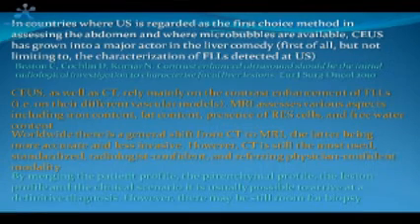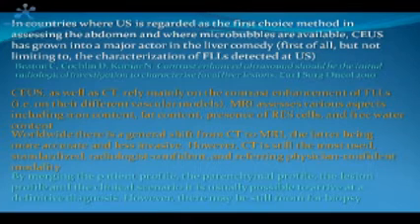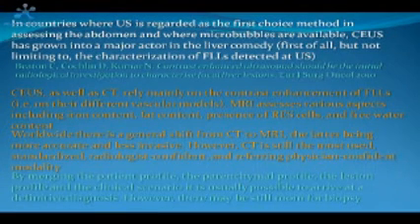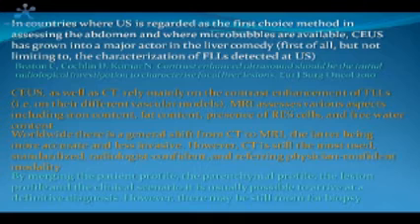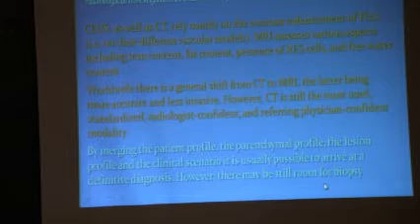As I tried to show you, if we merge the type of patient, the type of parenchymal background, and the type of lesion in the various clinical scenarios, in most cases we can achieve with CEUS or other imaging modalities a final diagnosis in a non-invasive way. Even today, I believe that in a number of selected cases there is still a place for biopsy, but it is the topic of another presentation.